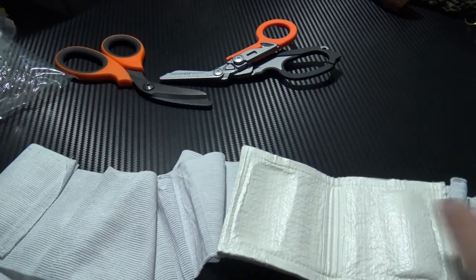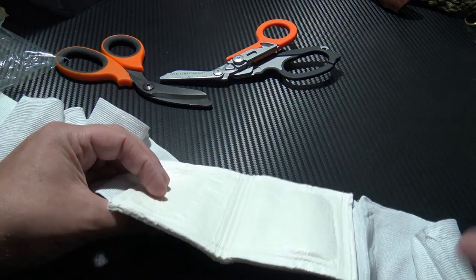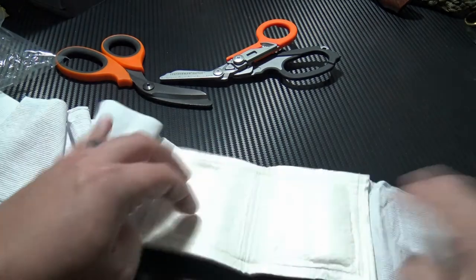It's a really cool little dressing — it's cheap, it's small, and it'll easily fit into an individual first aid kit that you carry on your person, or a more standard first aid kit you can keep in the workplace, the car or the home.